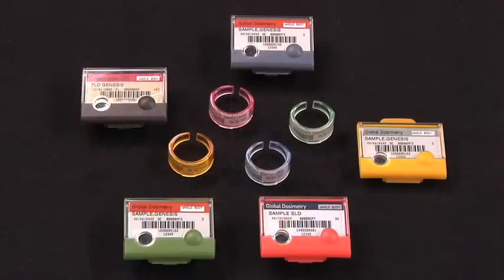In the past, the technology used for dose monitoring is called passive. That means a person wears a badge, they return it for processing, it's analyzed, a report is then issued, takes about 10 days, then the individual knows what type of exposure they received. In the meantime, they're probably receiving exposure while they have no idea what their previous exposure was.